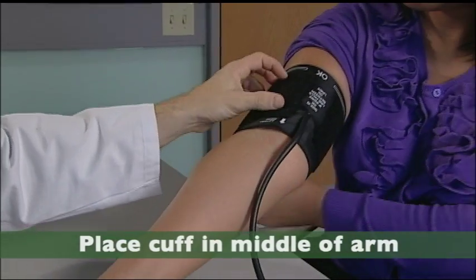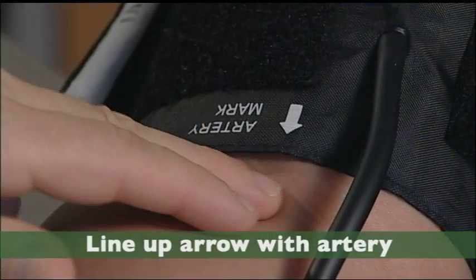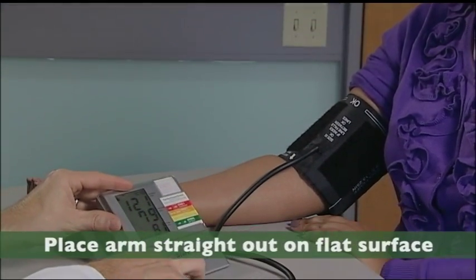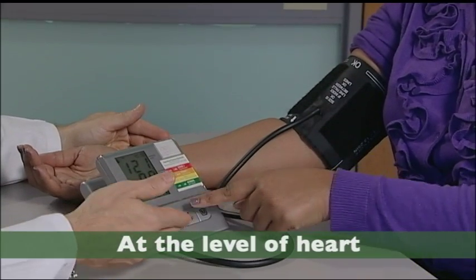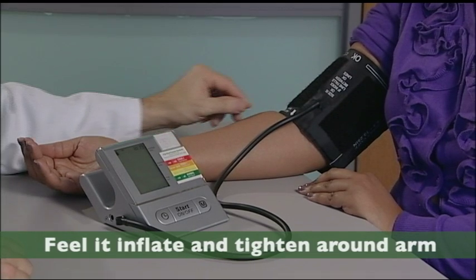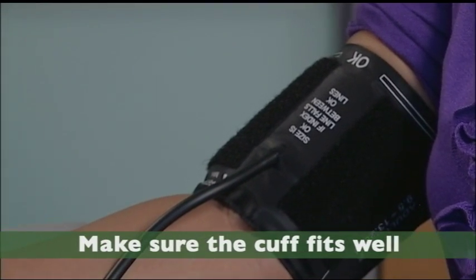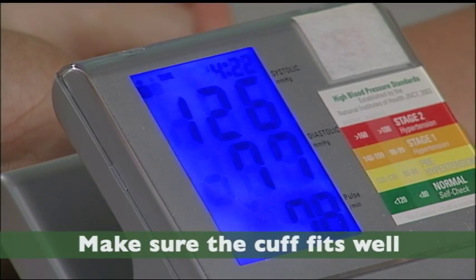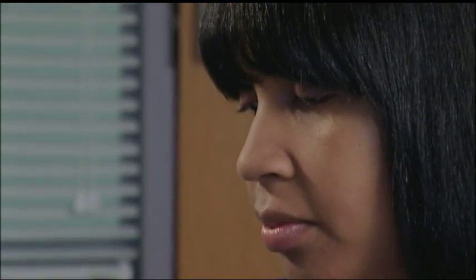Place the blood pressure cuff right in the middle of the arm. Line up the arrow with your artery. Sit up straight and place your feet on the floor. Place your arm straight out and rest it on a flat surface at the level of your heart. Press the button and you should feel it inflate and tighten around your arm. If the cuff was too small or too big, the blood pressure reading would not be correct. When you're at the drugstore, you can ask the staff for help in picking out the right size cuff.